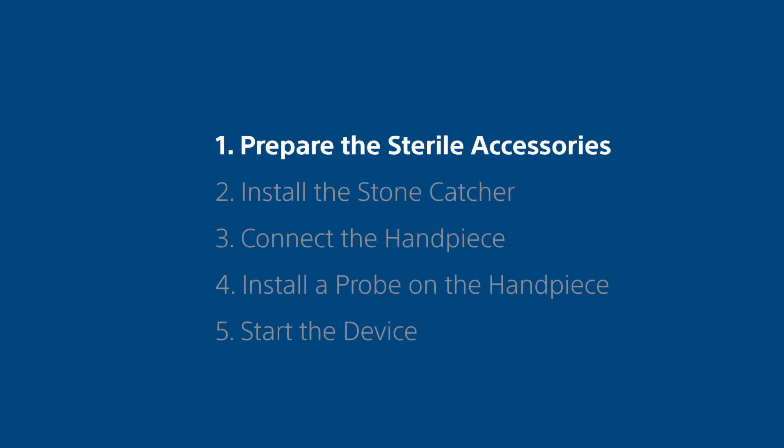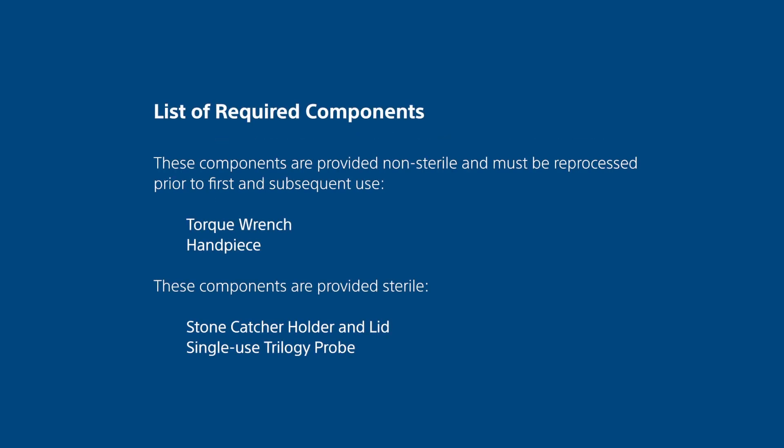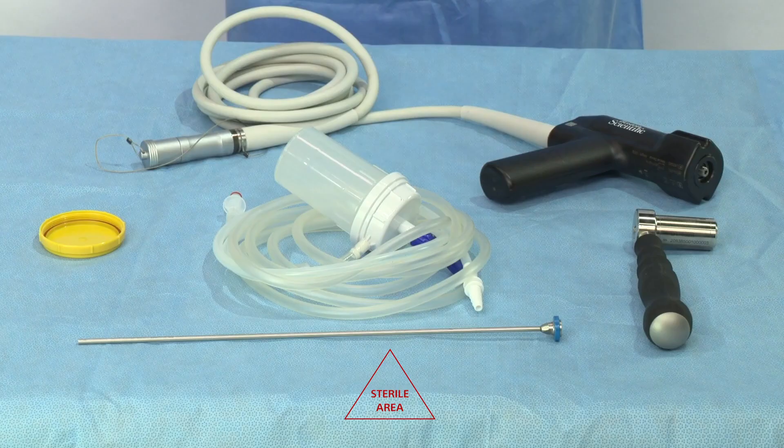Step 1. Prepare the sterile accessories. Place on the sterile table the sterilized handpiece, torque wrench, stone catcher, stone catcher lid, and the appropriate size probe.